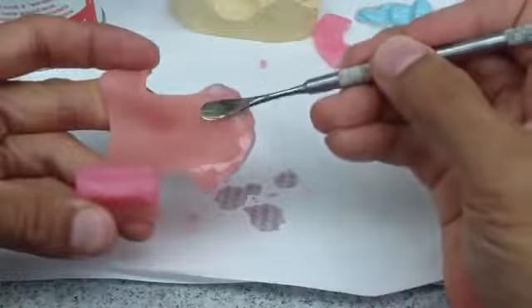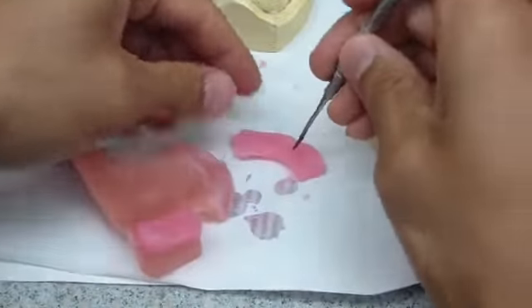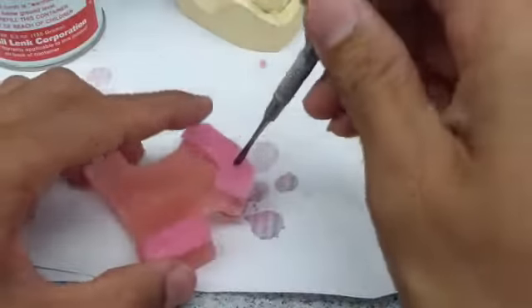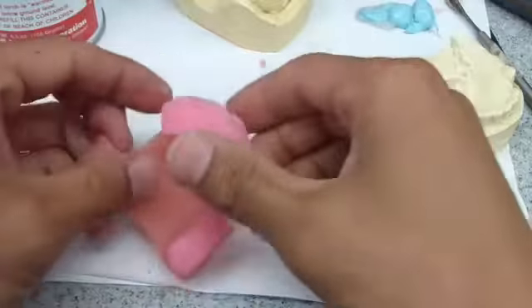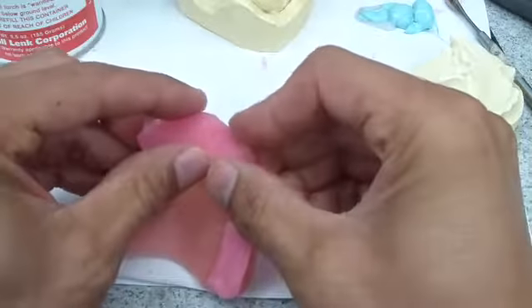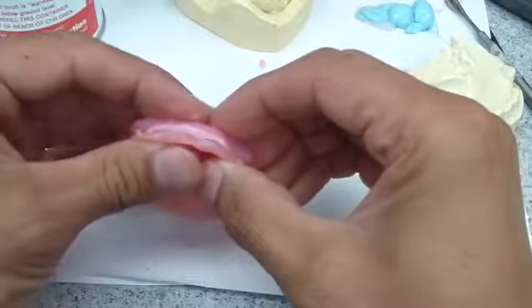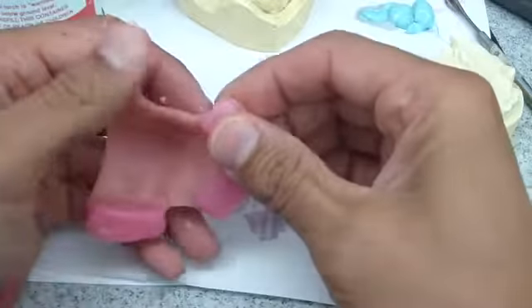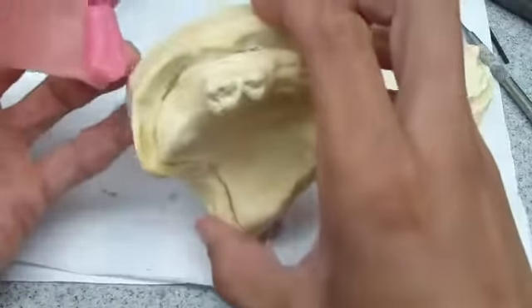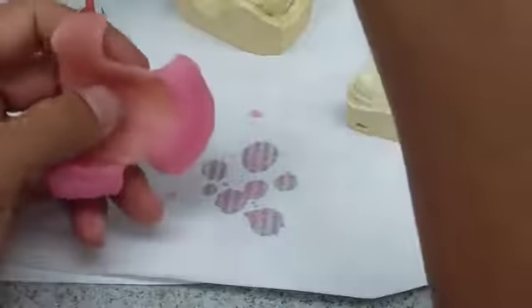And with regards to the instruments, any wax instrument will do. Okay, so what I'm going to do is heat up the bottom surface of that, and try not to burn my fingers. And we're not using this as an aesthetic wax try-in or for phonetics or anything. It's strictly a jaw relation record. So this will be the first point of contact, second against the mandibular partial denture, and the third will actually be his tooth-to-tooth contact. And we'll just clean this up now.